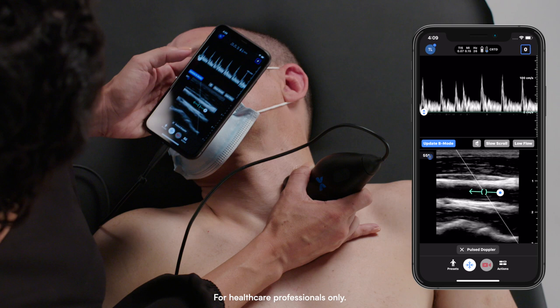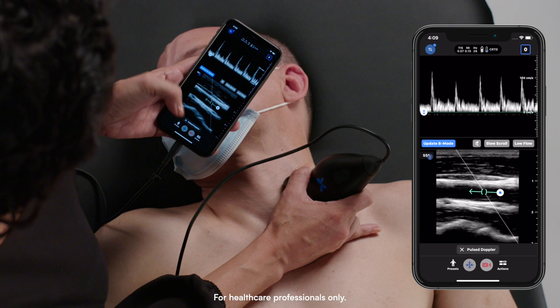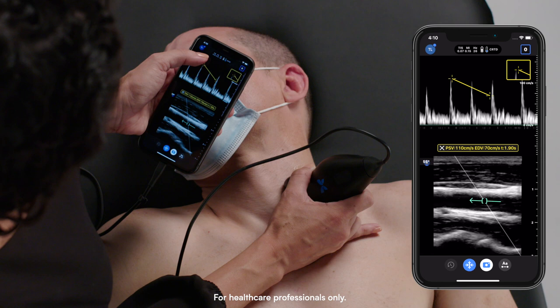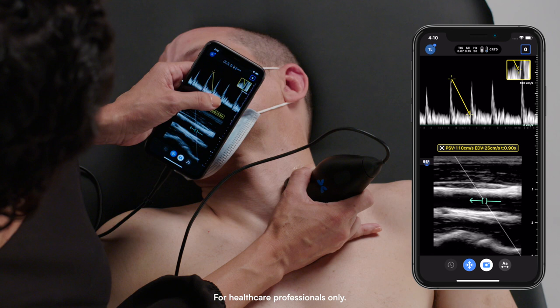To take a measurement, I'll press freeze. I'll go into my measurement menu and select line. I will place my first caliper on peak systole and take my second caliper and place it on end diastole.